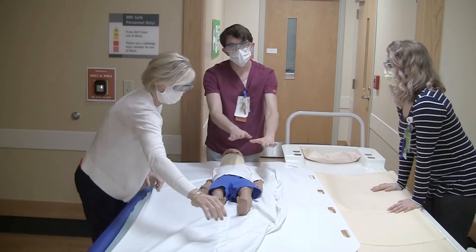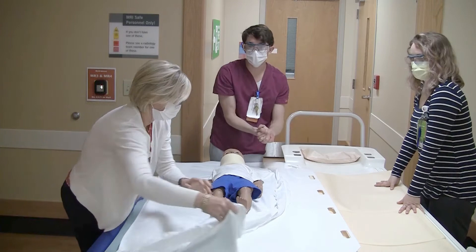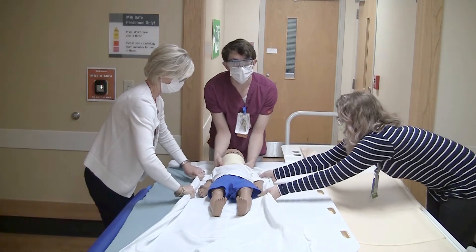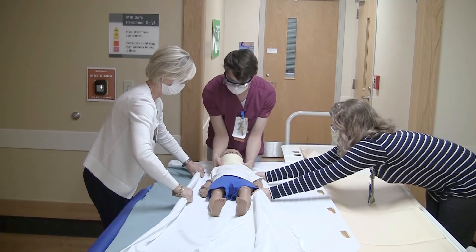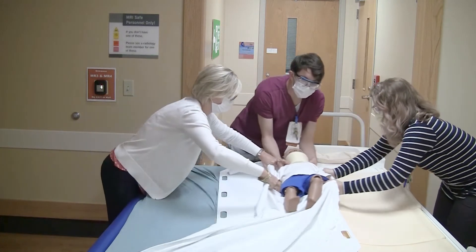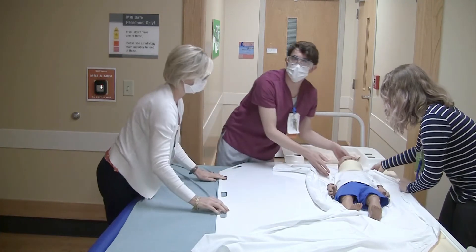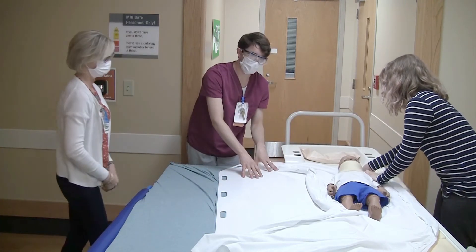The next thing we will do is use the board to slide them across to the new bed. Once again this will happen on the count of three. One, two, three. Slowly take the patient over, being sure to slide them, not lift them. That is the purpose of the slider board.